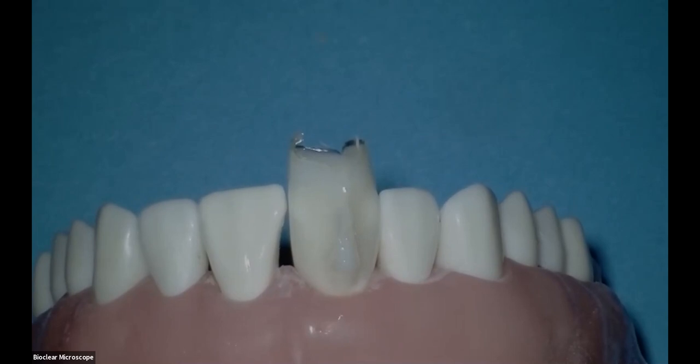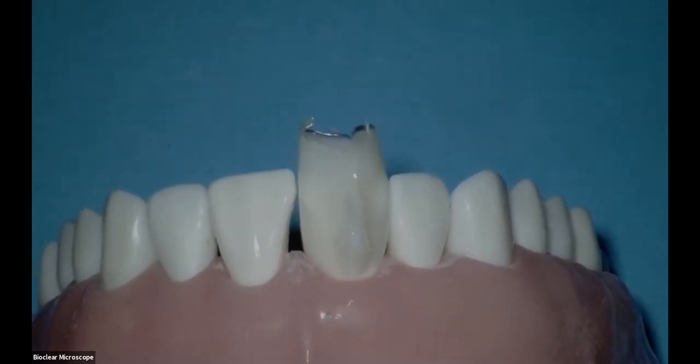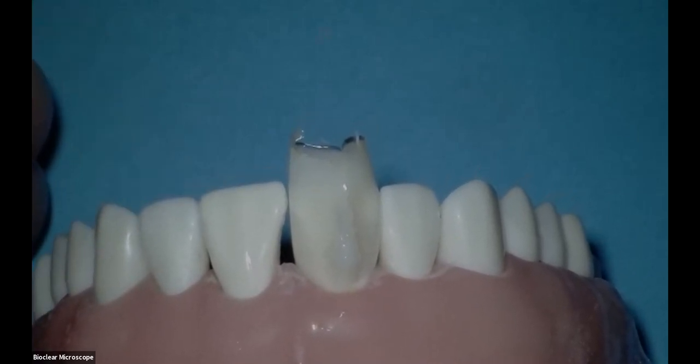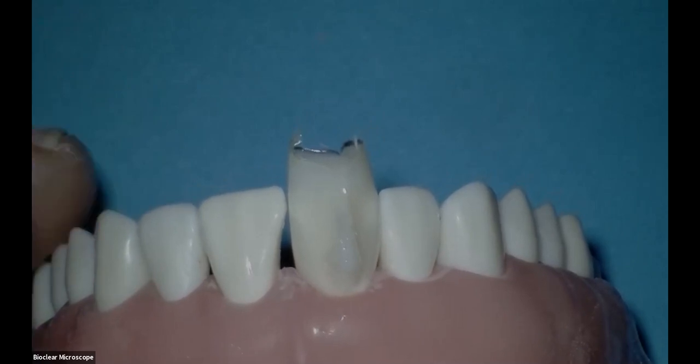It is amazing. And so a lot of doctors doing Bioclear are using a microscope, and when you do your first Bioclear case and you look under the microscope, you'll say, wow, that is dry. So it's one of the miracles of the Bioclear method. And it was something that really surprised me, how when you create that gentle lateral pressure of the matrix, we don't get bleeding or sulcular fluid.